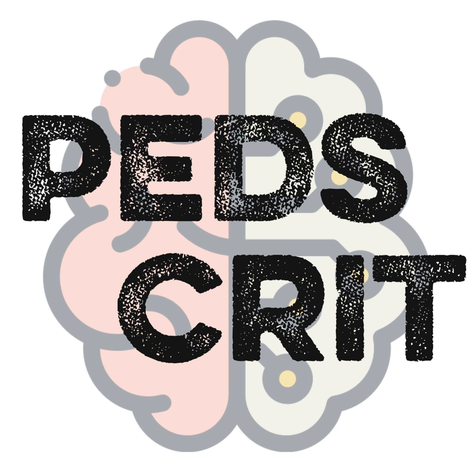For the setting of the NAVA level, in non-invasive ventilation, you won't make a lot of mistakes if you just pick a number anywhere between 0.5 and 1. To be honest, I would say let's start with 0.7 or 0.8. The point is that this patient probably has a high diaphragmatic electrical activity, and that's what you will check when you make the decision. You try to understand where the patient is and where you want to go. Let's say the patient has 40 microvolts of diaphragmatic electrical activity, which is high. It's higher than usual. Usually it's below 20. And so you have 40.